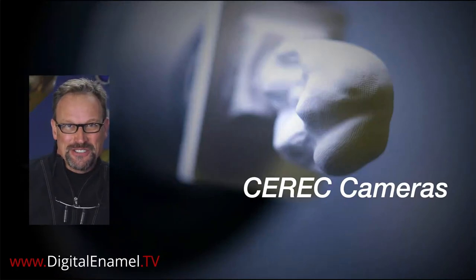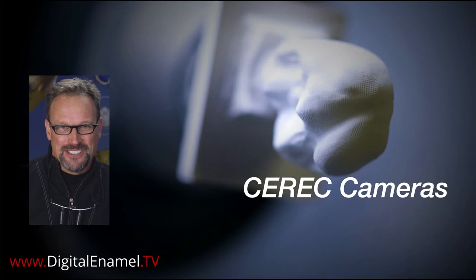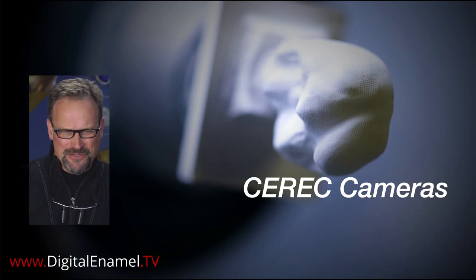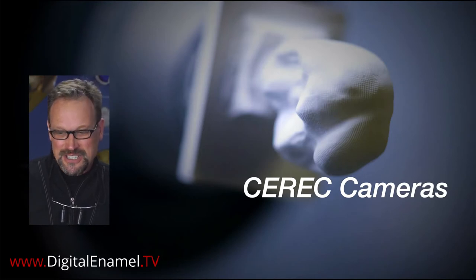I thought it would be fun to discuss the generations of CEREC cameras. I've got all of them except CEREC 1, which is basically the same as CEREC 2 and CEREC 3 - very similar. I thought we'd have a little fun talking about all of them and some nuances about each one. If anybody's still looking to learn about the blue camera or red camera, I still speak that language really well. In fact, I wrote the basic training for the blue camera years ago.